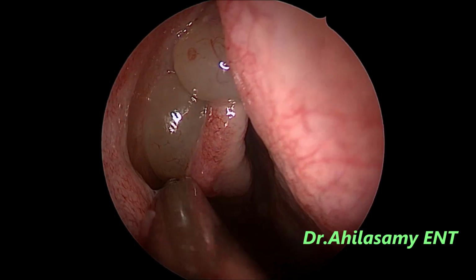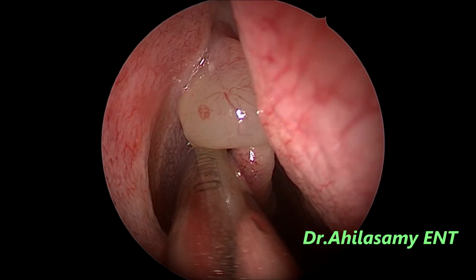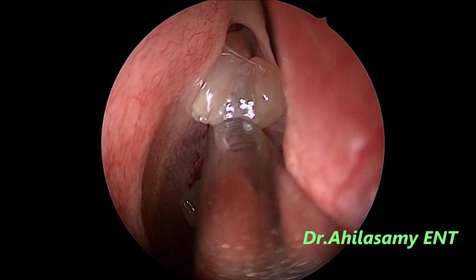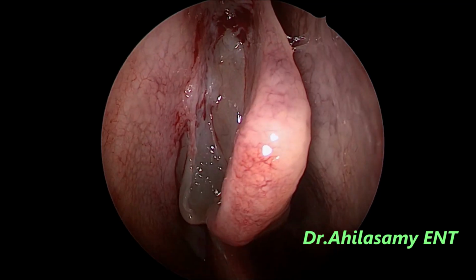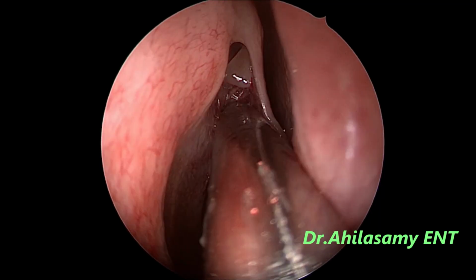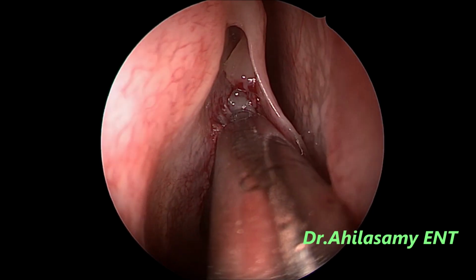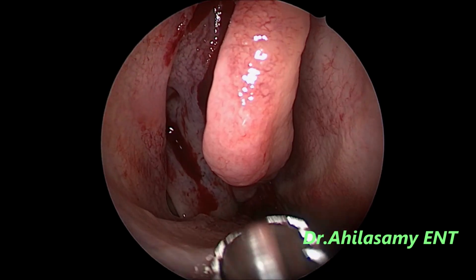Now I am going to the right side. There were some polyps in the right middle meatus originating from the right frontal recess. Using the same shaver system to take out the polyp. You can appreciate the field quality under local anesthesia in spite of the BP being around 150 and pulse around 70. Never operate these kinds of cases without a shaver system.